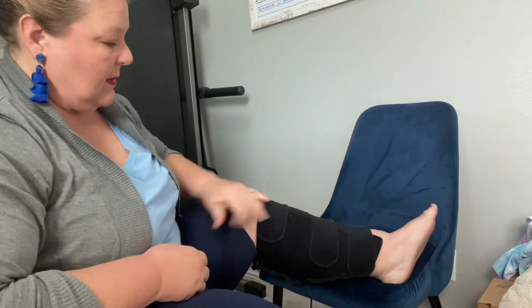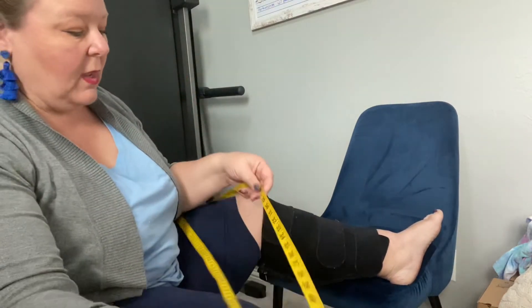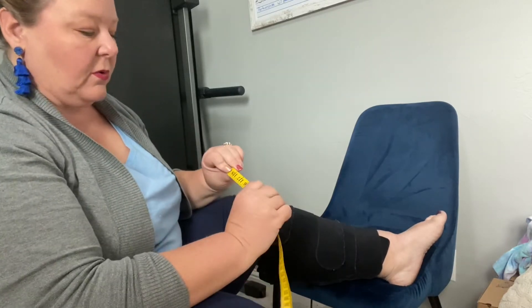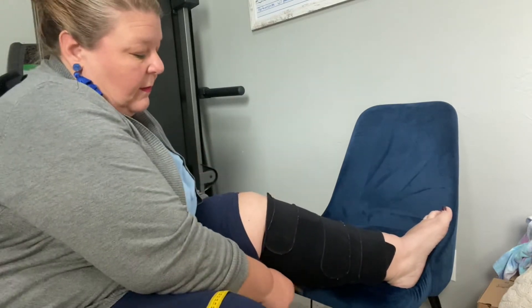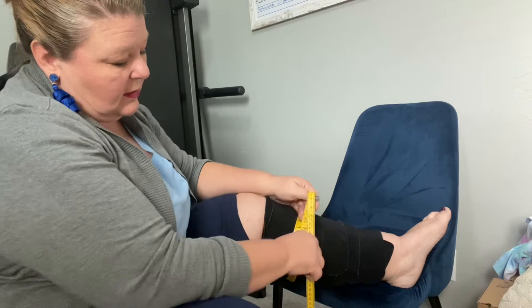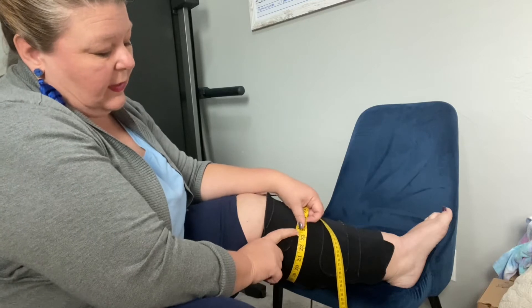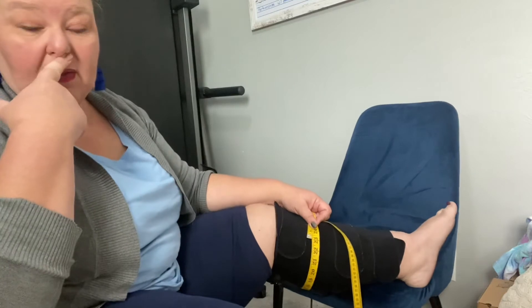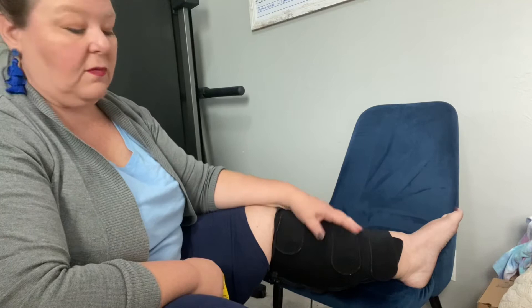We did my baseline measurements a while ago, and of course the neoprene adds some distance. My baseline measurement for the worst part of my leg was 23 inches. Right now on top of the neoprene it's right at 23 — 23 and an eighth or something like that. As the day goes on, if I do a good job of not swelling up, I should be able to go about halfway through the day and tighten this down again, and then my measurement will be smaller.